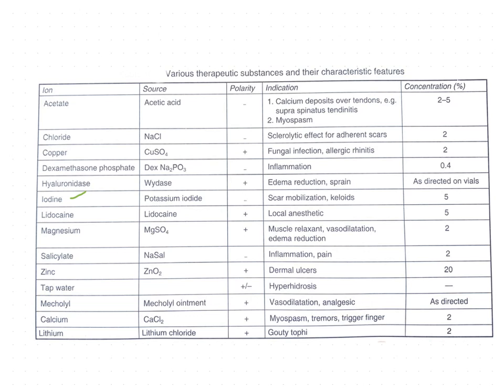These are obtained from a solution of potassium iodide and have an irritating effect on the superficial sensory nerve endings, and consequently the iodine ions increase vasodilatation and relieve pain by counter-irritation, which are normally obtained at the cathode. These are used in the treatment of chronic inflammatory lesions.